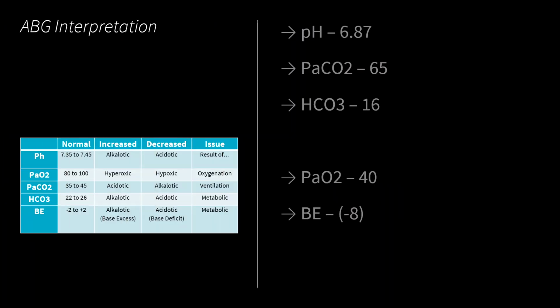Okay, well, we've got our first pH in the sixes, so this is critically low. Any pH below 7 should definitely garner your attention immediately, because we're in dire straits and in need to make some corrective action, especially depending on the disease pathology. So our pH is 6.87, that's well below normal, and so a low pH equals an acid. So we have an acidosis as our primary pH disturbance. We look at our respiratory system represented by our carbon dioxide. It's high. CO2 is an acid. We have too much CO2, so we have too much acid. So we have respiratory contributing.